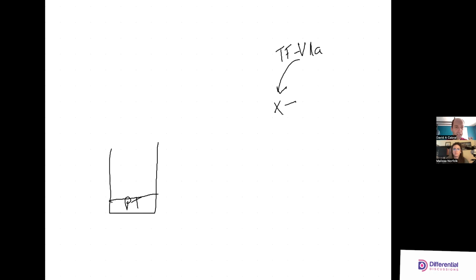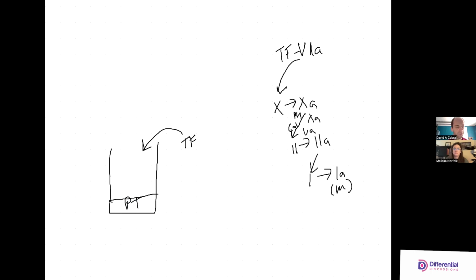So prothrombin reagent, if I remember correctly, contains phospholipid, calcium, and tissue factor. Is that accurate, Melissa? Yep. And if we remember, the extrinsic pathway starts with tissue factor 7A as our extrinsic tenase. So this will be acting and activating a lot of factor 10.